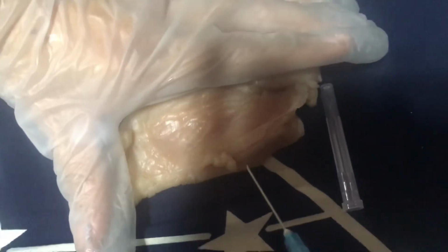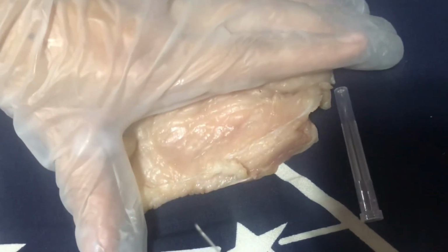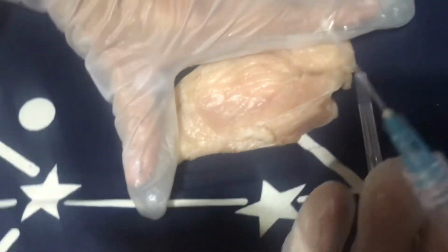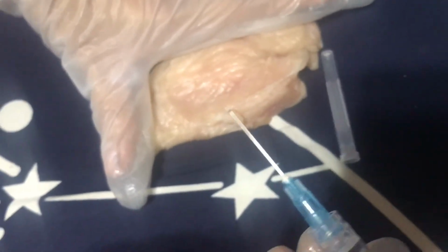Aspirate the syringe by pulling back the plunger with your dominant hand. If blood appears, you are not in the muscle. So remove and discard the needle and syringe, and start over. If no blood appears, proceed. So inject the medication slowly at the rate of 1 ml per 10 seconds. Wait 10 seconds and smoothly withdraw the needle.